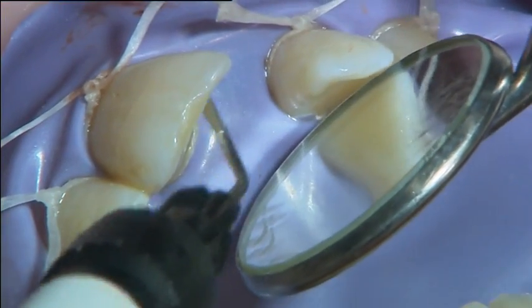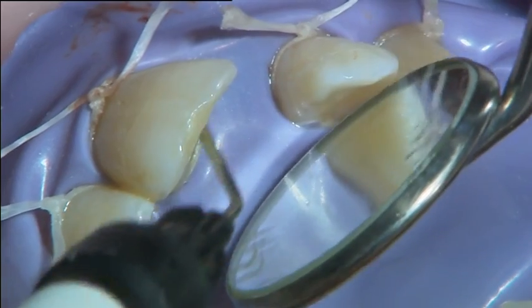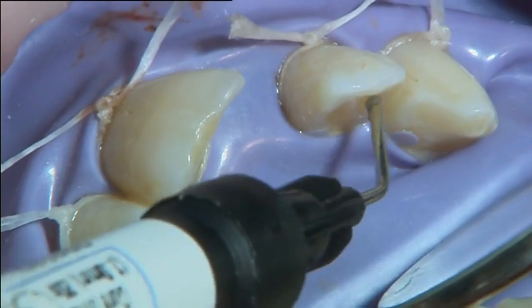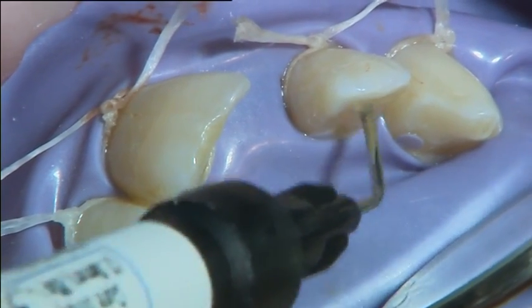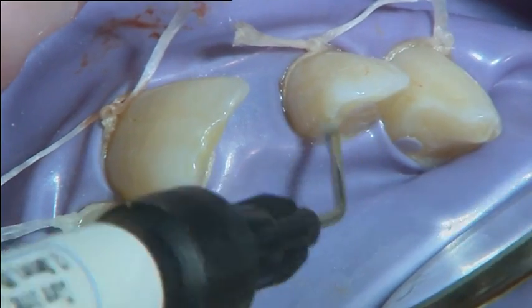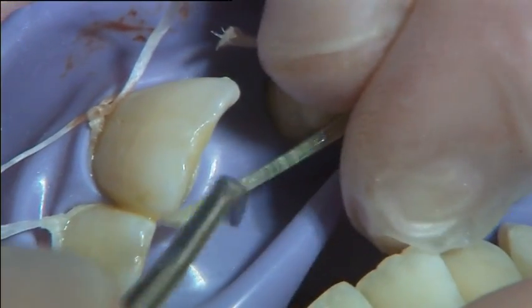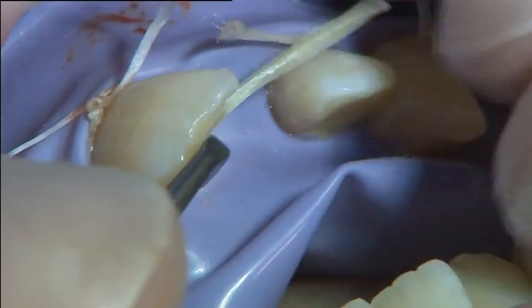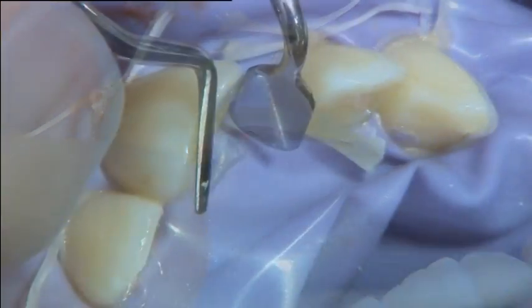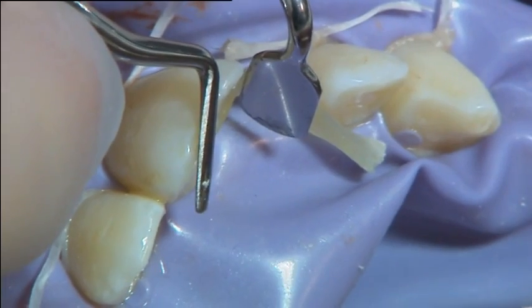A layer of flowable composite was applied onto the bonded teeth surfaces. The fibre bundle was placed close to the incisal edge on top of the uncured flowable composite, and adapted by pressing it down with a stick stepper hand instrument.